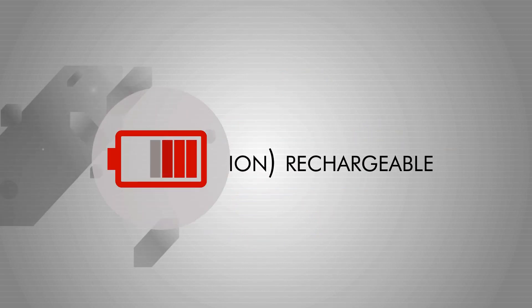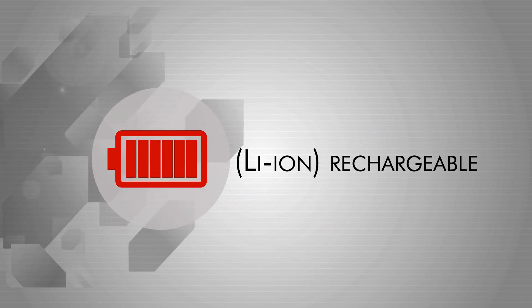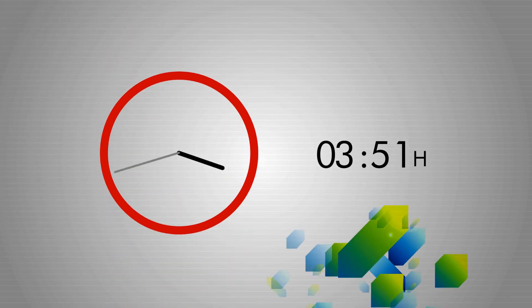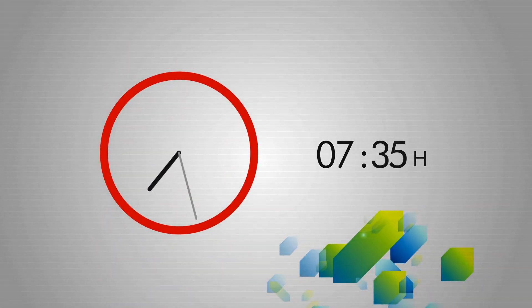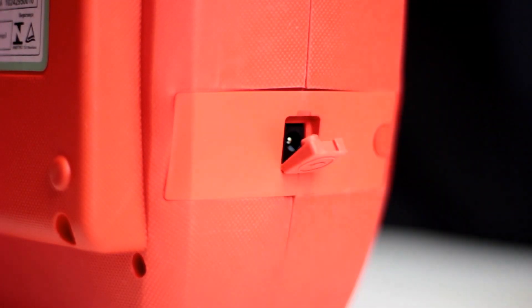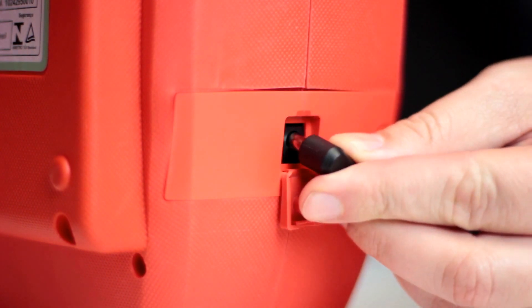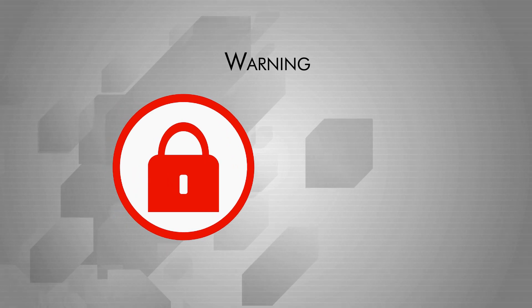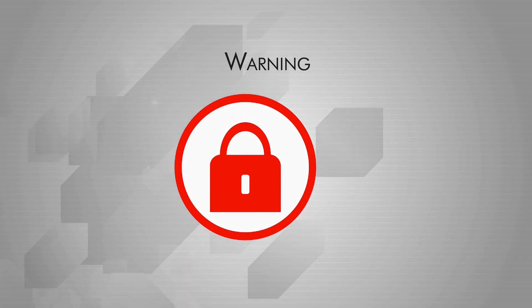The ESIS batteries are rechargeable. Before using this device for the first time, the battery must be charged to full for at least eight hours. To charge, connect the charger to the port on the side of the device, and then to a power source. Warning: this device cannot be operated while connected to a power source.